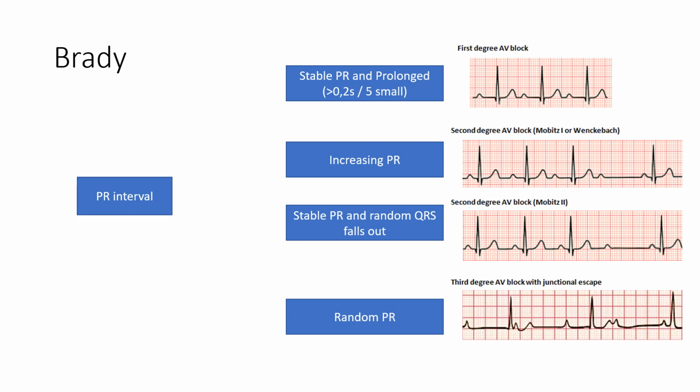Yeah, and it goes without saying that you can make a line in the middle here. Above this line, as a rule of thumb, you treat them only if they're symptomatic. The Wenckebach phenomenon is a somewhat physiological phenomenon to help ease the ventricles when there's a lot of activity going on in the atrium. But if they do become symptomatic, then they should also probably be treated.